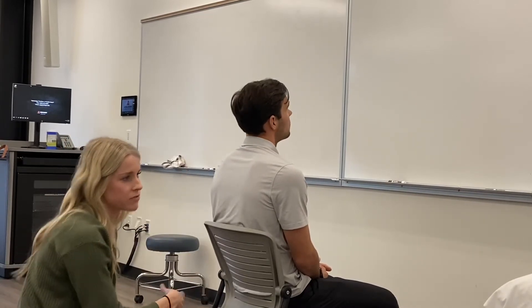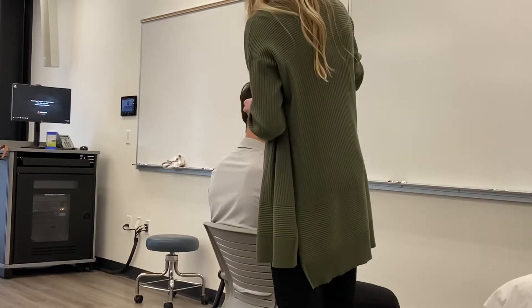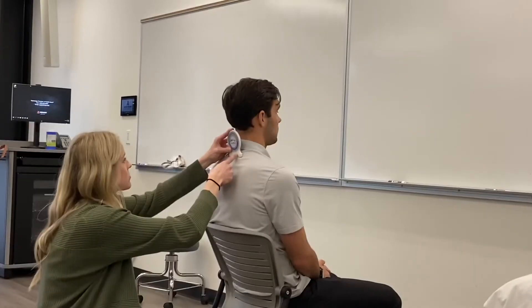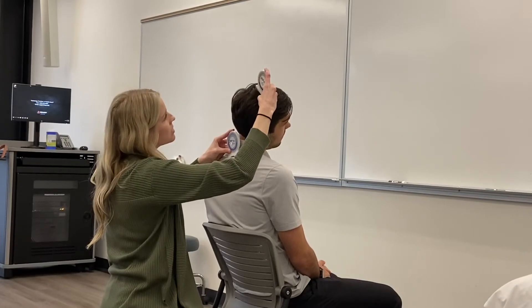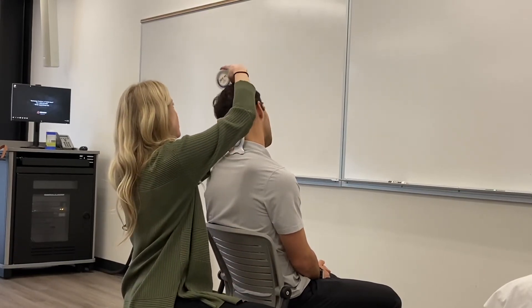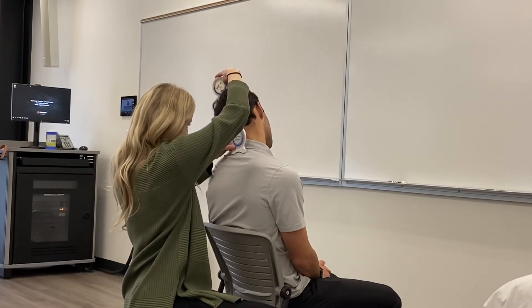Normal is 45. For the inclinometer, same patient position. One is going to be on top of the head, set to zero. The other one is going to be on the T1 spinous process, set to zero as well. He gets to 40 degrees on the head and his thoracic moved about five degrees, so you're going to subtract — 35 total. Other way: this one's at about 50 and he moved five again, so 45 coming this way.